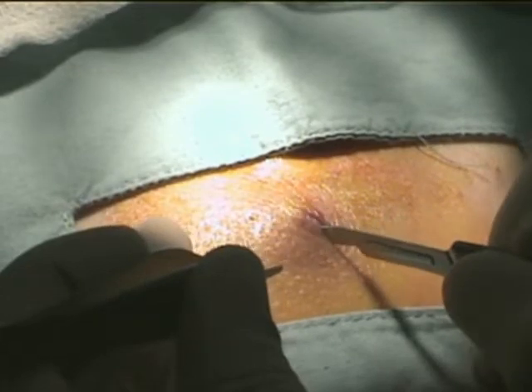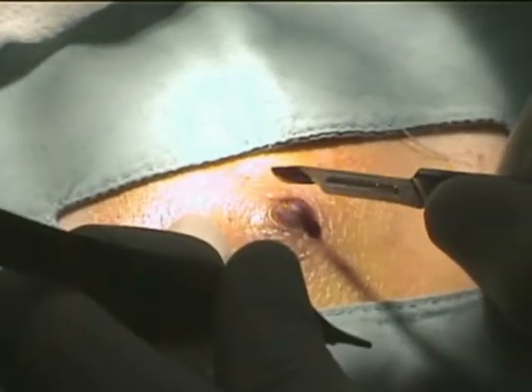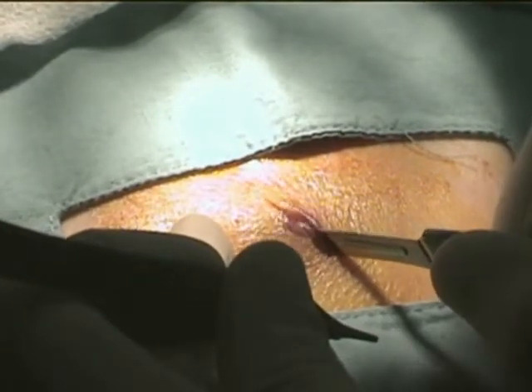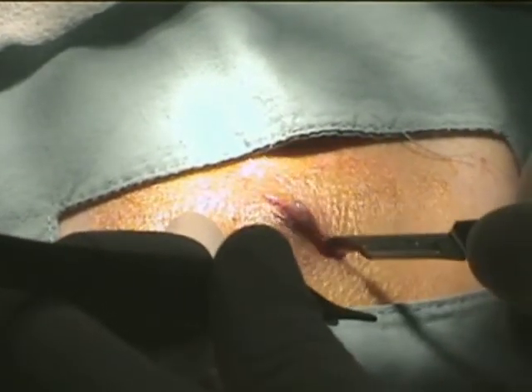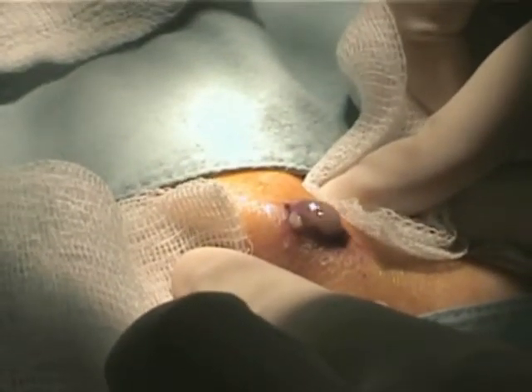Make an incision with a scalpel blade to allow drainage of the abscess cavity and to prevent premature closure of the incision. When possible, make the incision along the skin lines. Apply gentle external pressure to express all of the pus.